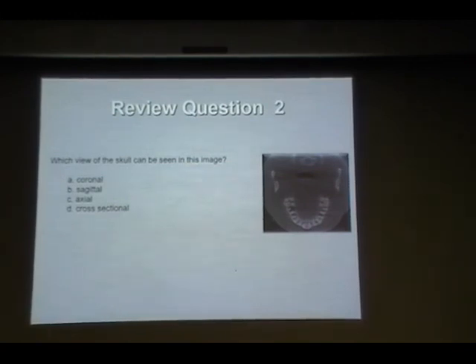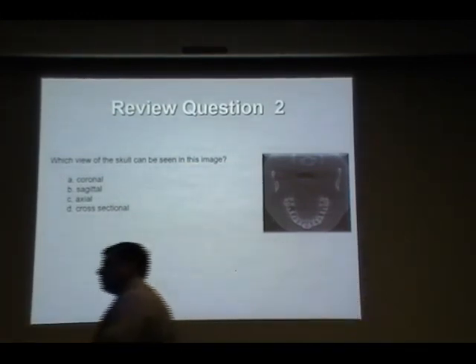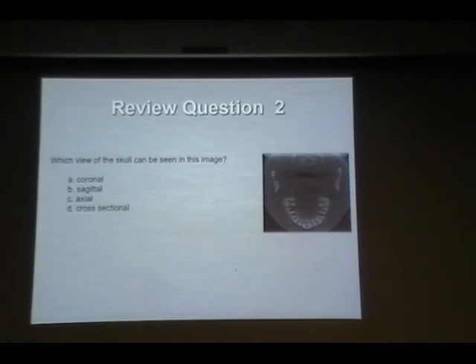I don't know if it matters or not, but in vascular dynamics, we always call this view horizontal. But here we always call it axial. Is that the same or are they two different? Axial is the preferred term. Horizontal we don't use at all. But it does mean the same. Horizontal is the plane, not the vertical. Okay. That makes sense.